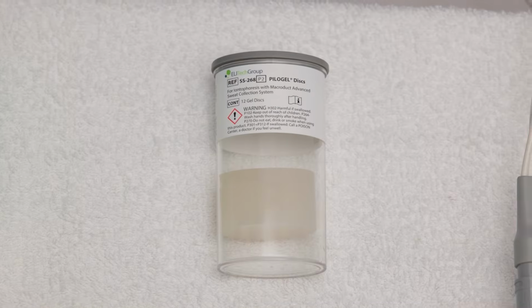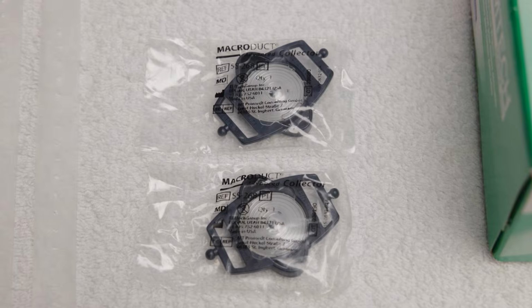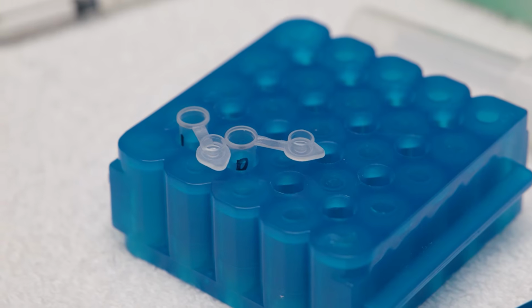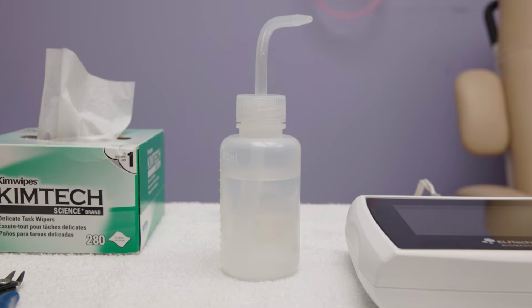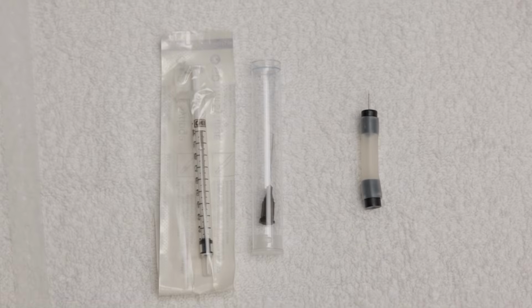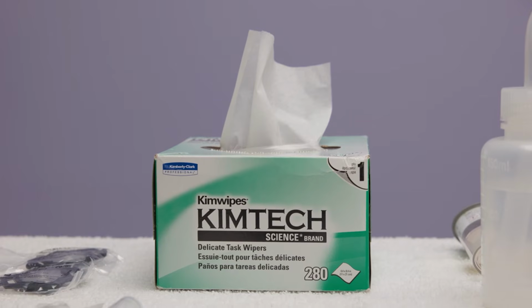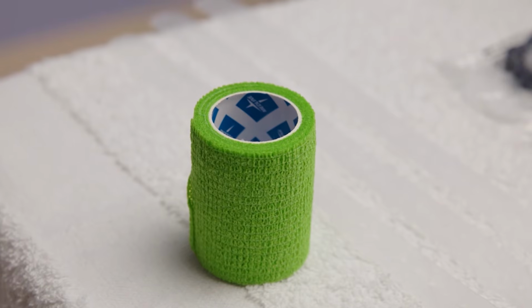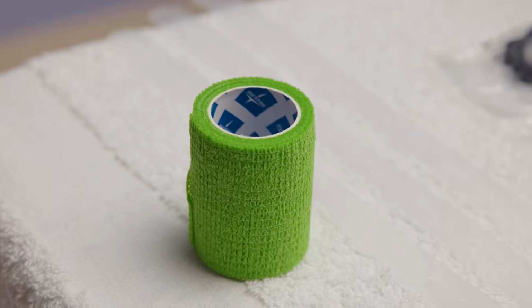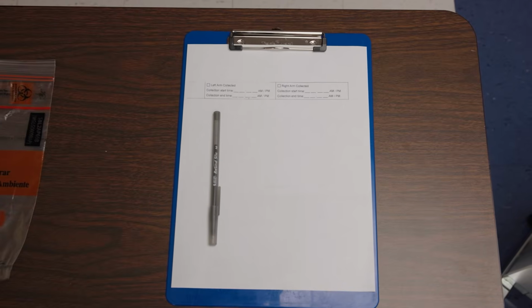Other equipment include 4 pilocarpine gel discs, 3 to 4 electrode and collector straps, 2 coiled tubing collectors, 2 small sealable containers for sweat, and a rack to hold them upright, nippers, clinical laboratory reagent water, either a sweat dispenser or TB syringe with blunt-tipped needle, gauze or laboratory tissues, alcohol swabs, self-adherent elastic wrap, which is useful especially for testing young children, timer, in addition to the built-in timer in the inducer, and a pen and paper.